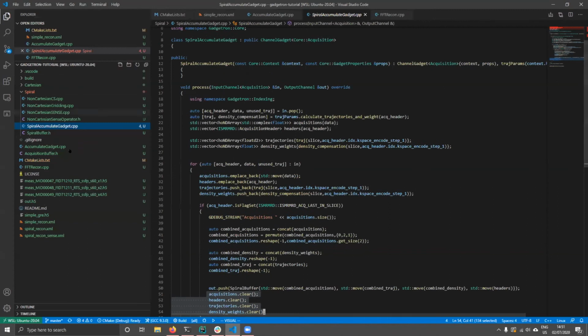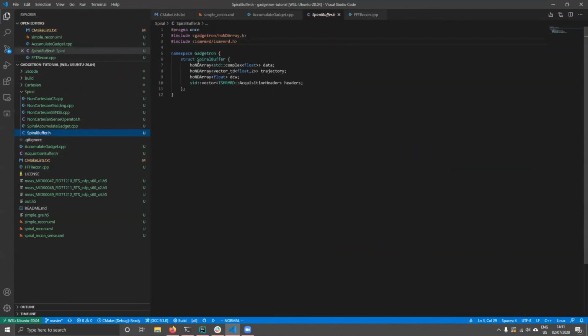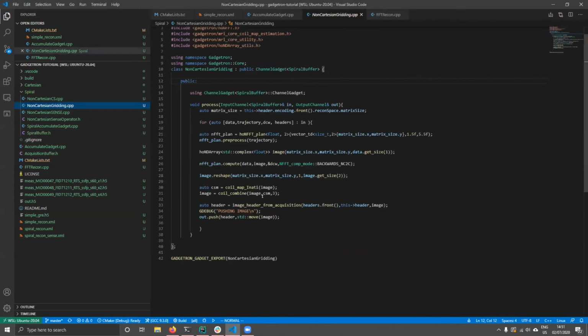And that brings us to a quick look at the spiral buffer. It's pretty simple. It has the data, the trajectory, the density compensation weights, and the headers. So let's look at the gridding gadget, which is pretty simple. First we need a matrix size, because in the Cartesian case, we could just infer what the image size was from the k-space size itself. We can't do that in non-Cartesian, so we need to grab it from the header.